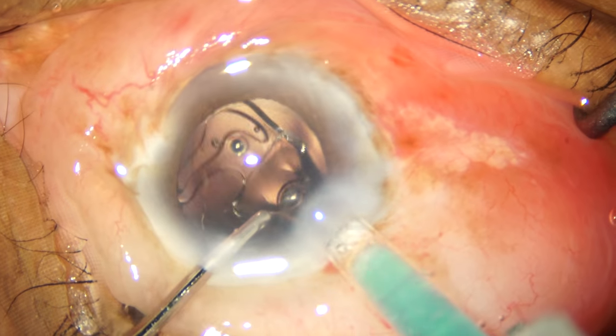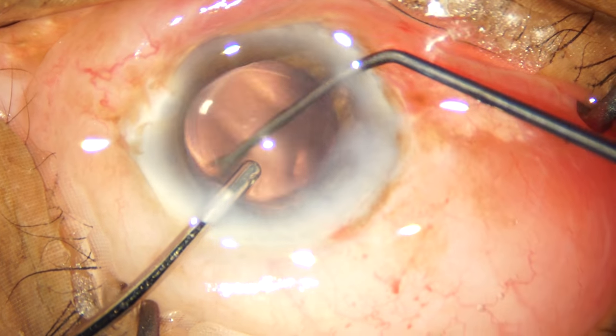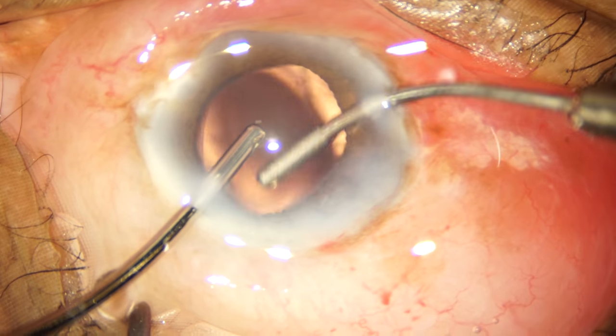A single-piece hydrophilic acrylic IOL is implanted and nudged into the bag, and the overlap between the capsulorrhexis margin and the optic is adequate.